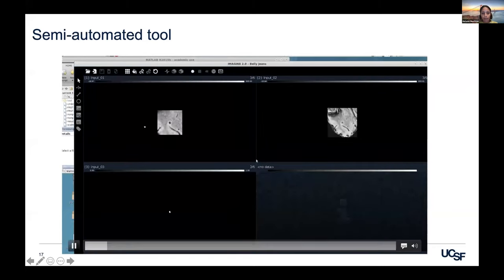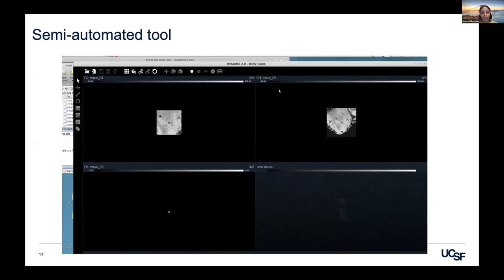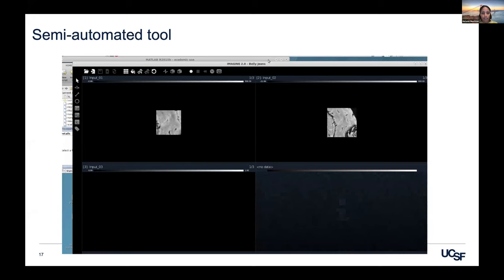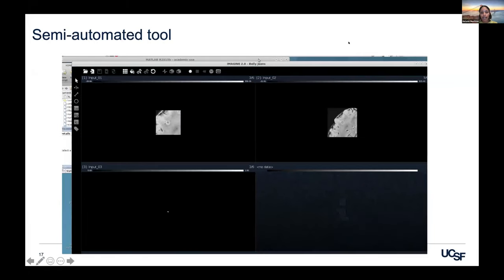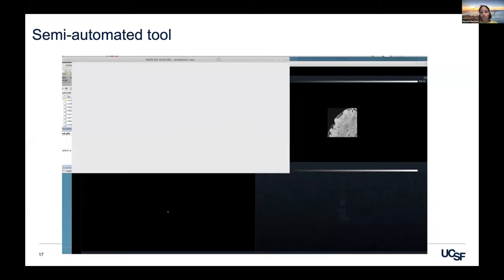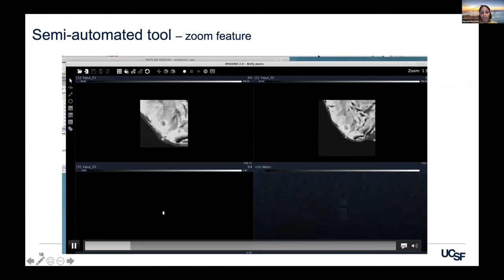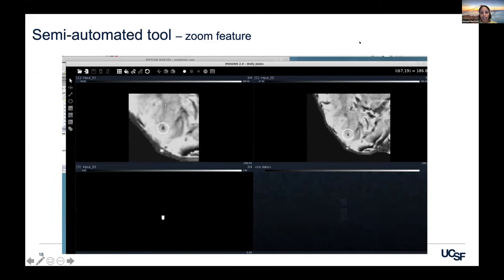In the GUI demo, you can tap through slices and see candidate microbleeds. One that is consistent throughout all slices in one location is clearly a microbleed. The algorithm also gives a hint if it may be a hard mimic, and you click yes or no and proceed. A microbleed that is traveling clearly across slices is a vessel — you mark it no. If a microbleed appears in only one or two slices, that's usually not a true microbleed. The GUI also has a zoom feature useful for smaller microbleeds, especially in irradiated patients.